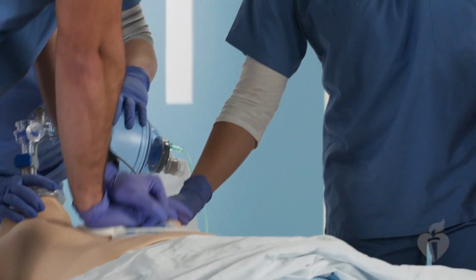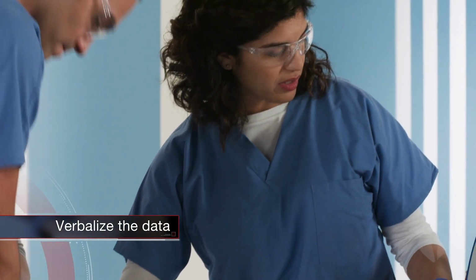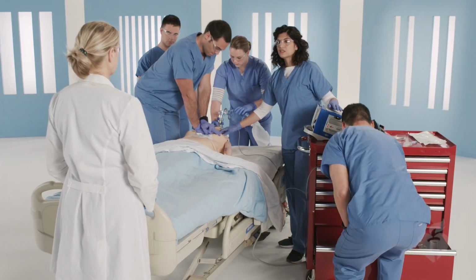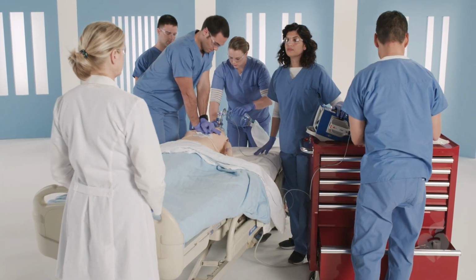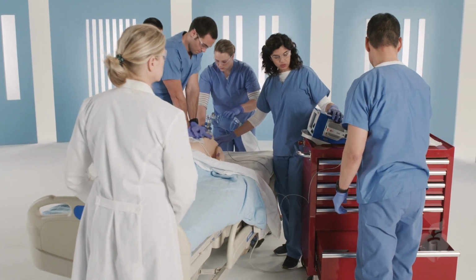Now that the CPR coach is in place, they should verbalize the data from the feedback device, providing corrective and positive feedback, such as "Push harder," or "Your rate is good. Great job, you're right on target."